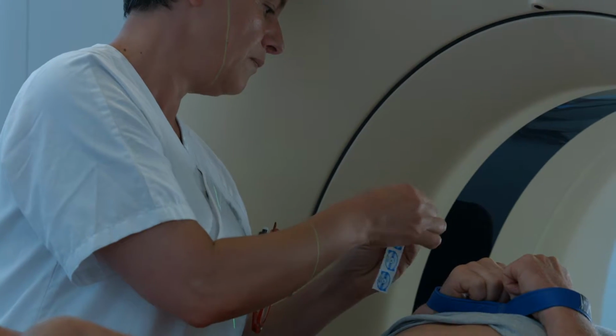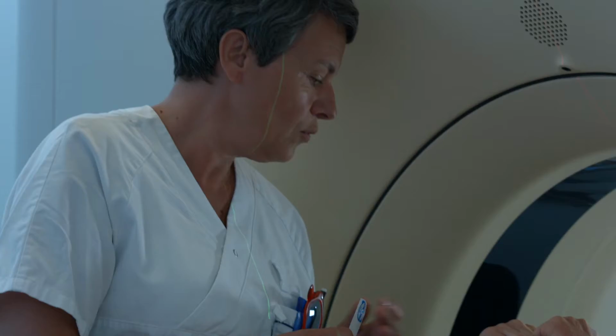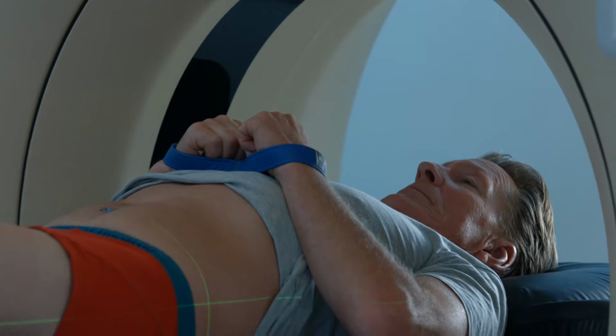During the examination, an irradiation point is set. To be able to find this point during the treatments, small marks are made on the skin or on the fixation mask.